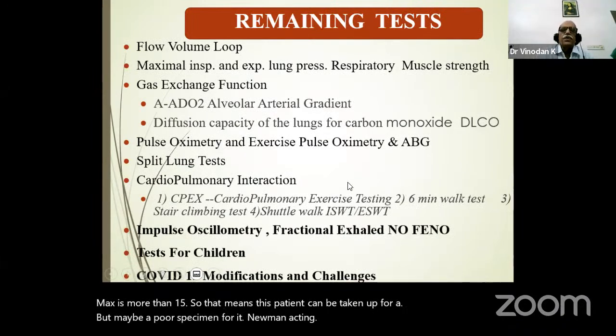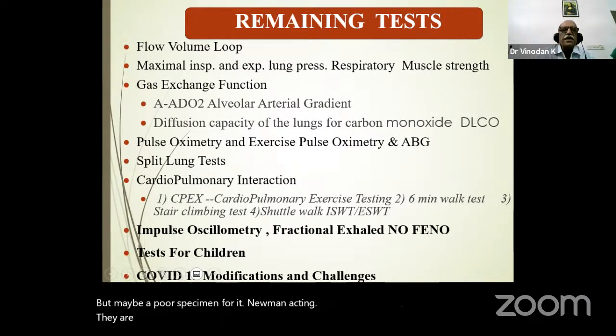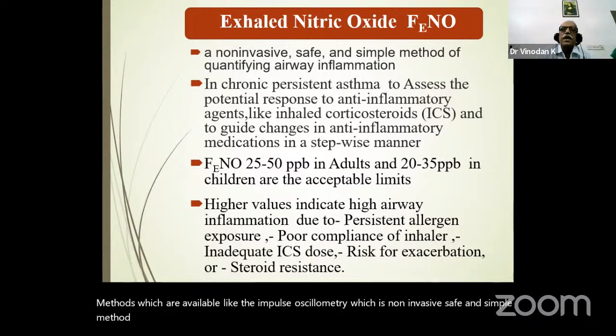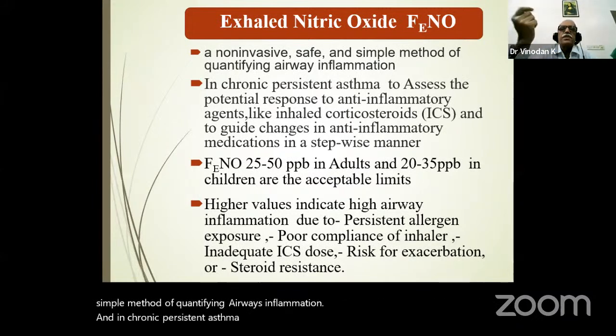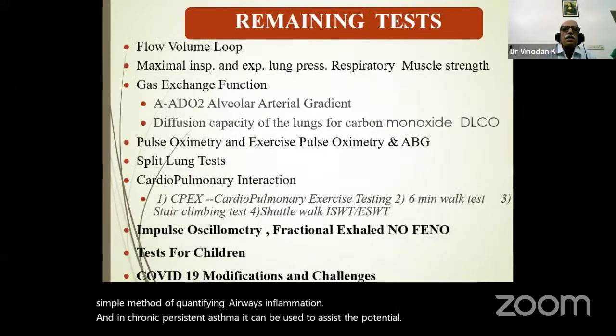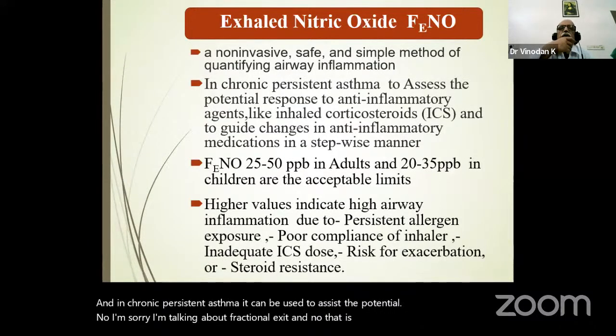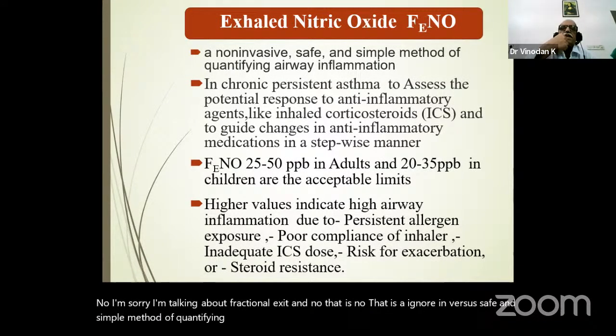There are also new methods which are available. I'm sorry, I'm talking about fractional exhaled NO, that is FeNO. That is a non-invasive, safe, and simple method of quantifying airway inflammation.